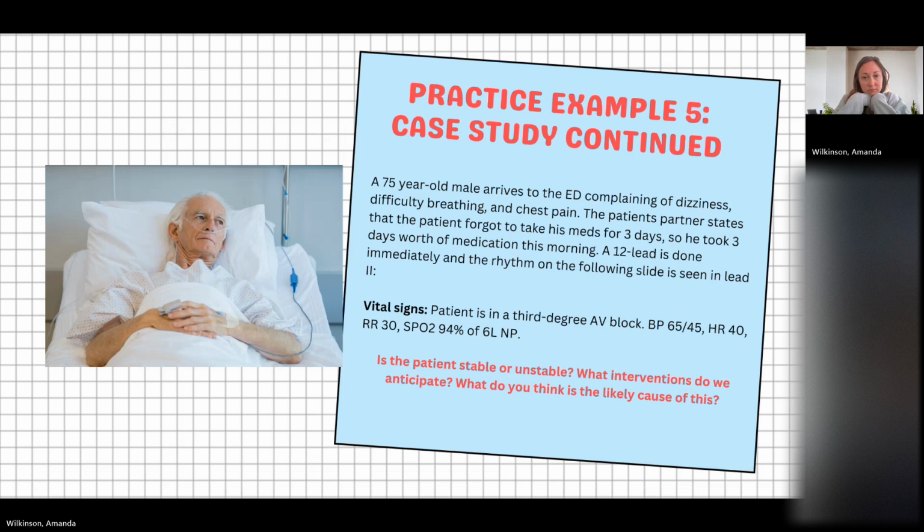So firstly, put on the monitor, make sure all the IVs and oxygen is on, and pace transcutaneously first while they are trying to put in the transvenous pacer, because I'm not sure whether transcutaneous would keep going, and then he needs a permanent pacemaker, looks like. Perfect. Yeah, most likely it would be transcutaneous pacing and either shipping to somewhere that can do transvenous or right to the cath lab as well.